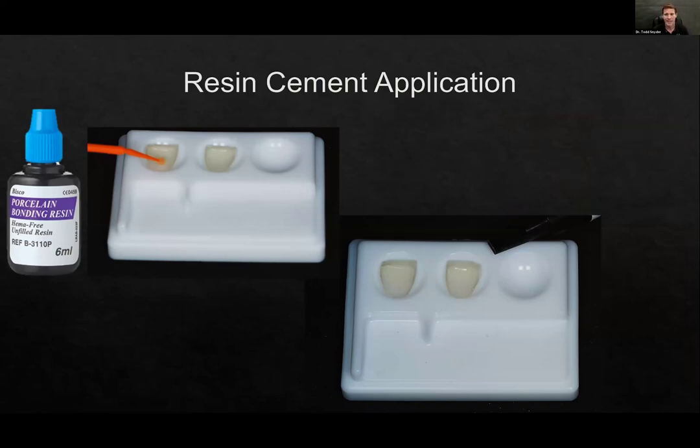So understand that this has no strength property to it, all right? This is literally an unfilled resin. You're going like, well, what the heck would I use that for? It doesn't have any strength properties. That seems odd. Okay, think about going back to dental school, unless you still pour up your own models, which I do. Think of the debubblizer, the surfactant. Oftentimes it's a pink spray that you'd spray on an alginate before you put the stone in there on the vibrator. And so the reason you sprayed your alginate with that surfactant was to break the surface tension to allow your stone material to flow more easily into all the little grooves of the impression, right? So you didn't have bubbles or porosities or problems. Well, to some extent, this is doing the same thing.